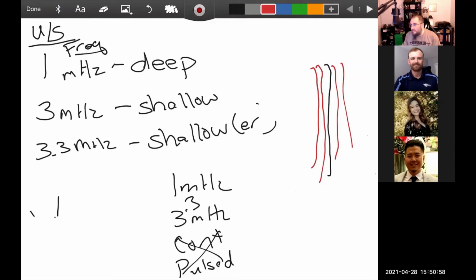When you get on the spine itself, you can nail the horn cell and cause some discomfort. It's not going to kill them, but it could be uncomfortable. Again, I've had students doing the whole low back. Technically, if you're doing the whole low back, you should do the right side of the back, shut the machine off, stop it, go over and do the left side of the back separately.